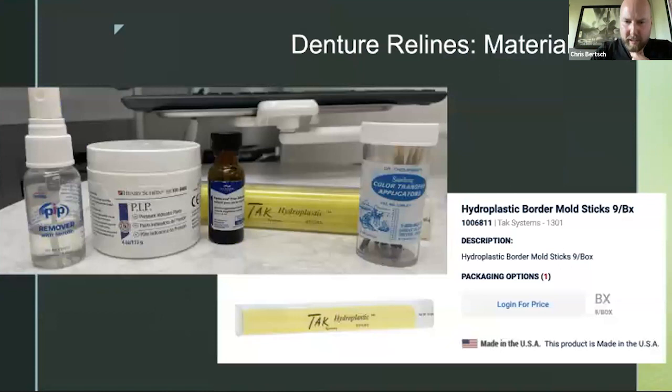I sometimes have problems scanning the outside palate. Yeah, for that one, what I do when I'm scanning the outside palate, I wish I had a denture to pretend, but I'll start on the occlusal surface and just scoop underneath the palate and go back up in one fluid motion and then do it again, always picking up at the occlusal surface of the teeth and then scanning down to the other occlusal surface of the teeth, and then starting at the very back. So when you've done the reline and have the material, I'm just trying to find a picture.